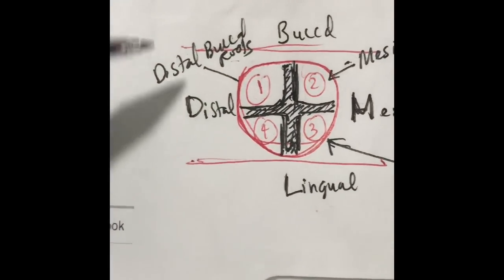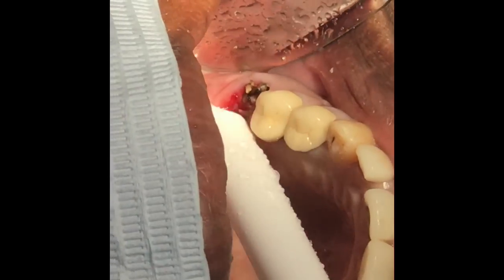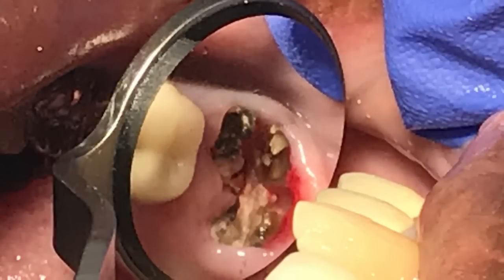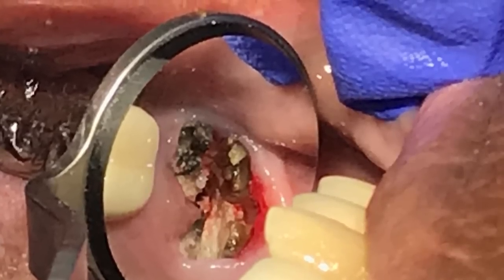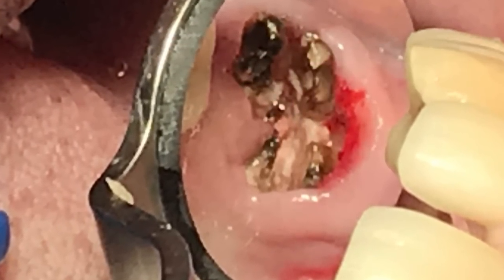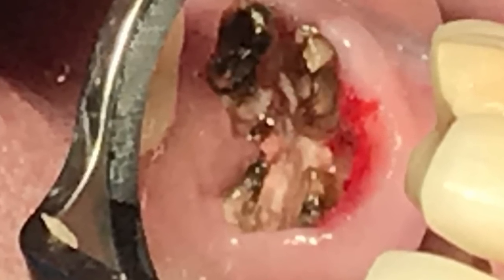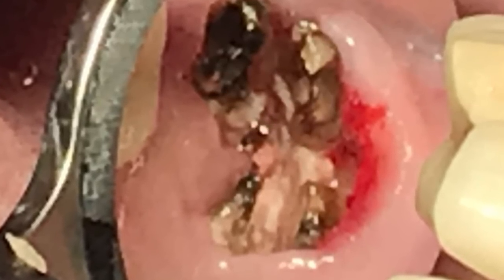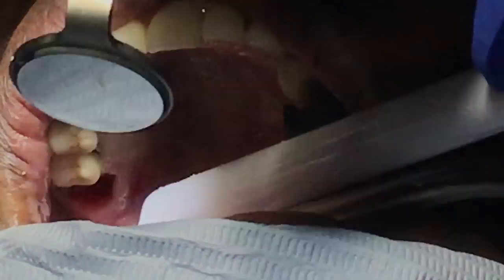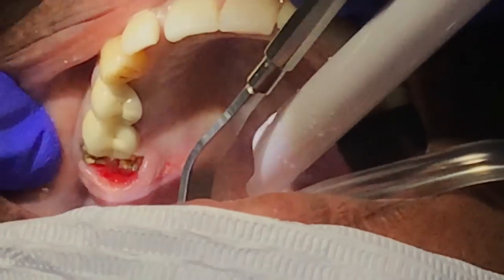Just one at a time it comes out nicely. Looking at the two-dimensional image on the x-ray while you are working on a three-dimensional clinical case, you have to make sure you are aware of the environment around the tooth, the sinus, and the adjacent tooth. Stop every couple of steps so you can evaluate how deep you go into each section. Make sure you are not going past the bone — just around the bone or one to two millimeters below is fine. I constantly stop and check with the mirror to see how far I go.